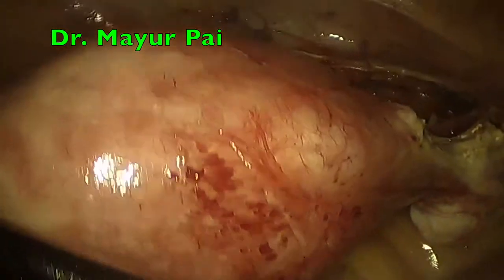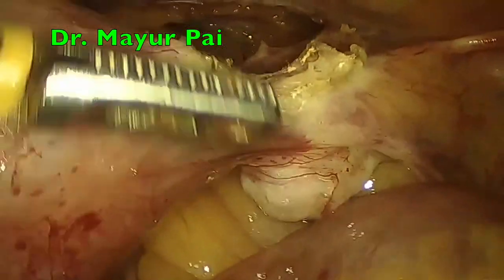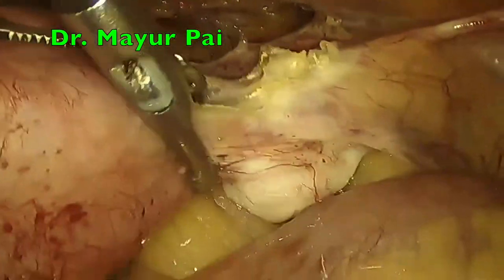Here we see that the round ligament and the ovarian ligament have puckered a bit, and there's shortening of these ligaments. We can also see the absence of the fallopian tube on this end. Also, the scarring has been there. It was an open surgery.